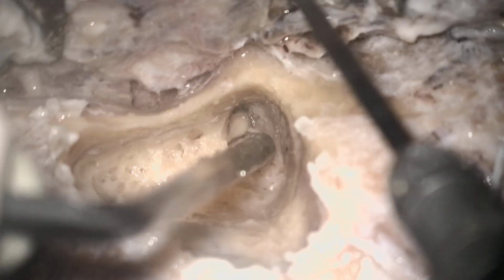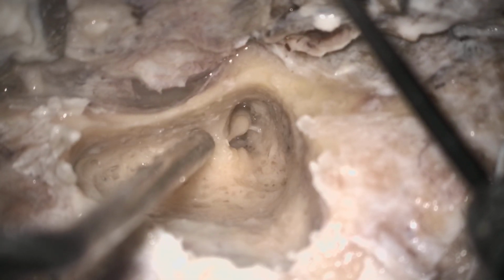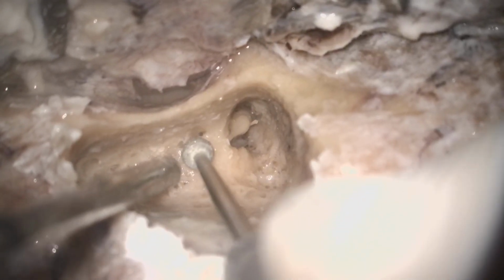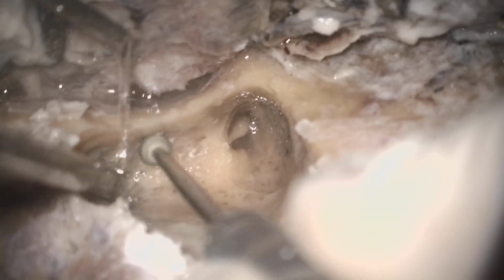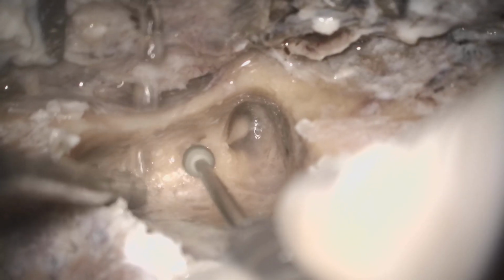And look, give some water. You fill the space with the water, then suck this from the cellular area, and look, all the water is getting sucked from this area. So that signifies that this cell tract has a direct communication with the middle ear cavity. If you have damaged the external auditory canal and you have gone far anterior, then whenever you are sucking the water, it will not come through this opening. So this is a water test we usually do while doing the posterior tympanotomy in live surgery.